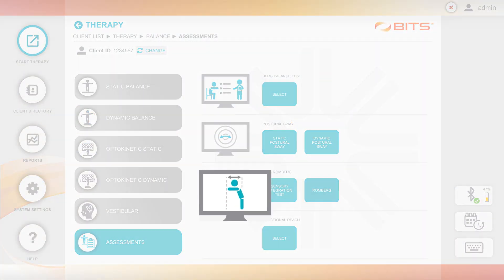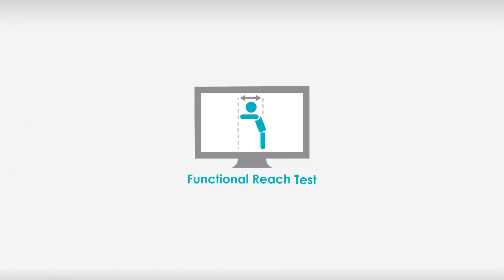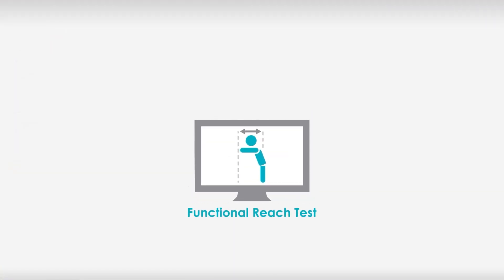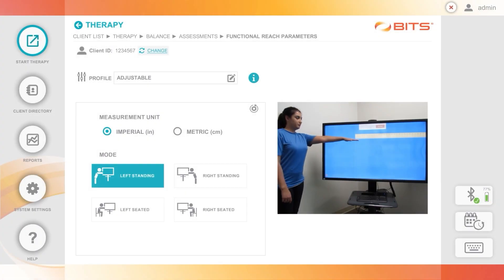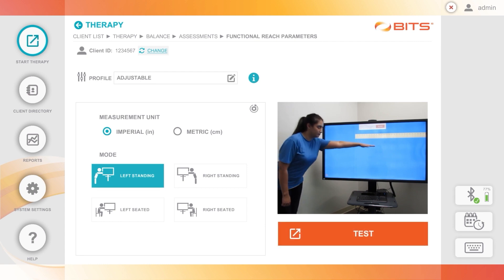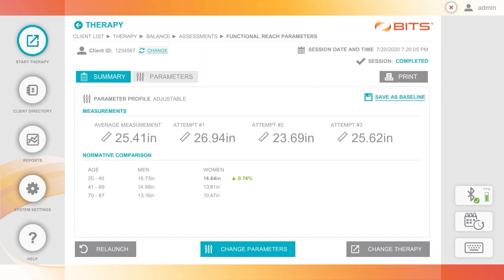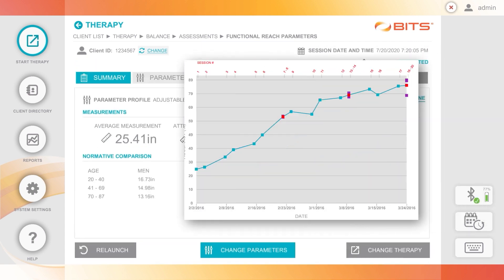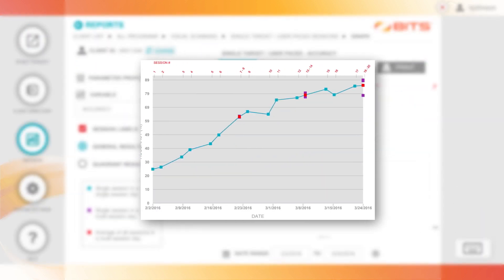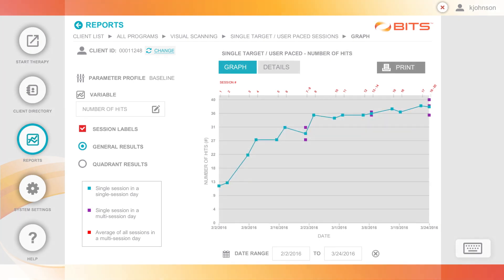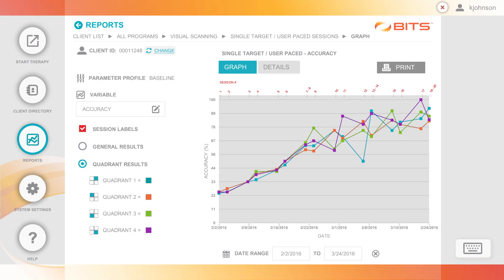Standardized assessments, like functional reach, have been digitized so you can leave the paper and pencil behind. Plus, smart reports make demonstrating outcomes easier than ever.